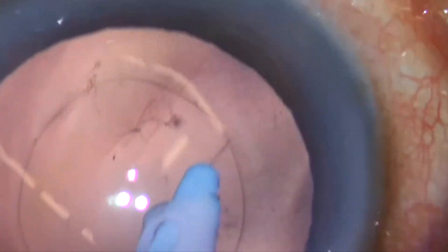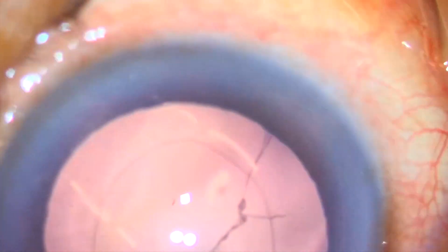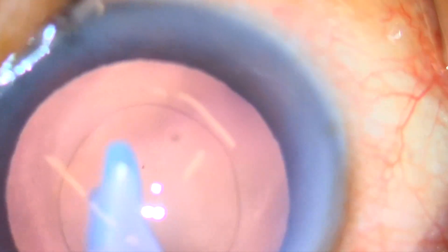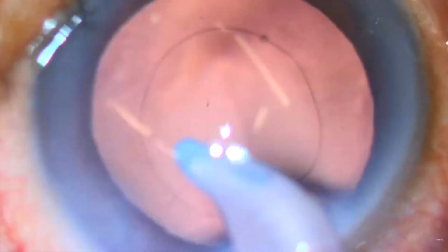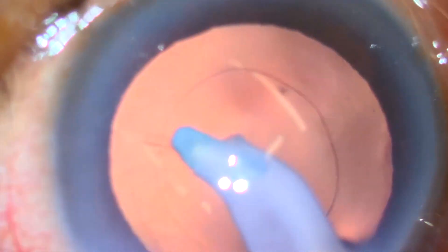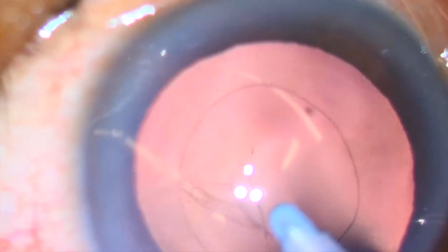We use a tangential sweeping motion to remove the larger cortical fragments from the equator of the capsular bag. Then we're left with fine strands of cortex that are adherent to the capsule and can be visualized on the posterior capsule through the microscope. Here we see the capsule develops a horseshoe tear, probably because our aspiration was too high for this capsule. So we identify the tear immediately.